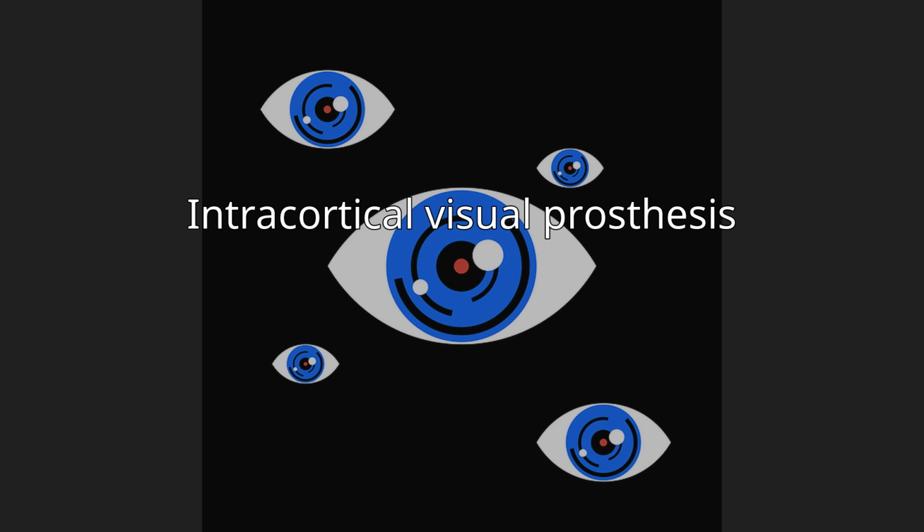Arrays of activated iridium oxide film (AIROF) coated electrodes will be implanted in the visual cortex, located on the occipital lobe of the brain. External hardware will capture images, process them, and generate instructions which will then be transmitted to implanted circuitry via a telemetry link. The circuitry will decode the instructions and stimulate the electrodes, in turn stimulating the visual cortex. The group is developing a wearable external image capture and processing system to accompany the implanted circuitry. Studies on animals and psychophysical studies on humans are being conducted to test the feasibility of a human volunteer implant.